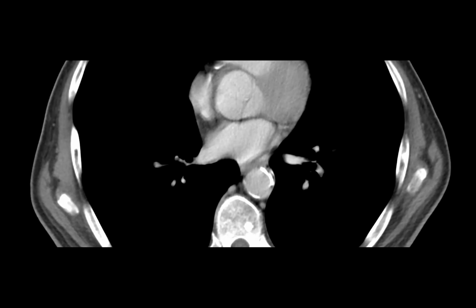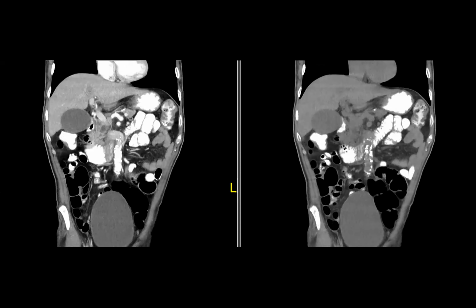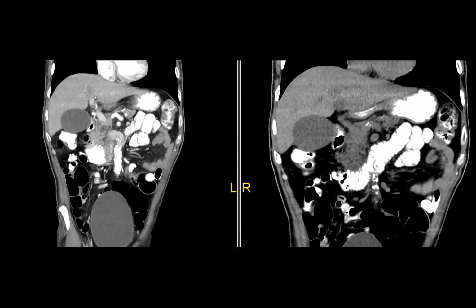Looking at the coronal was one of the differentiating behaviors. You pick up more mets from the liver on coronal than axial. The other interesting finding was that subspecialists picked up more mets than generalists, but for certain types of metastasis, like mets along the edges, both generalists and subspecialists missed them equally. Right. I remember.